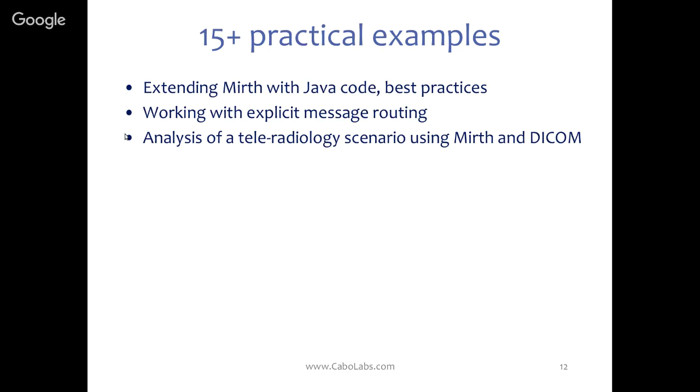And we will finish the workshop with an analysis of a teleradiology scenario. And we will do a small test with sending DICOM objects to Mirth and analyzing the content of the DICOM objects. But we will talk about a full scenario when you extract images from a modality, you store that in a local PACS, you send that to a remote clinic that does the diagnosis.